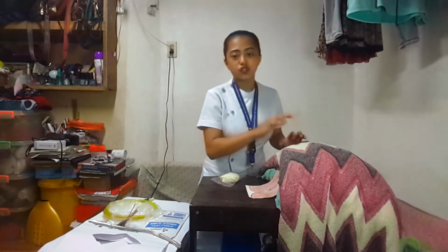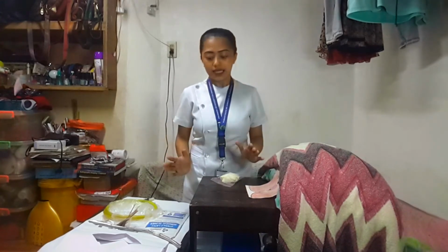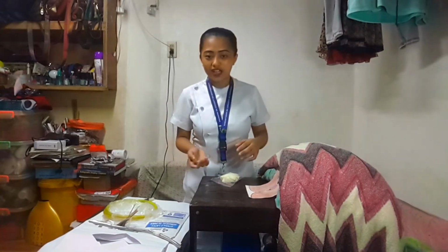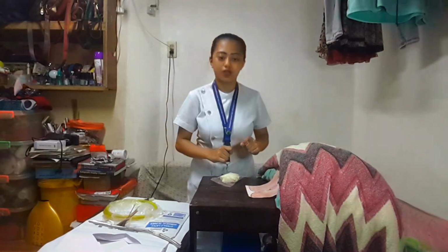We need to position our patient in supine position with knees slightly flexed, about two feet apart, and of course the hips should be externally rotated. The rationale for that position is that we can easily access the vagina and easily insert the catheter.